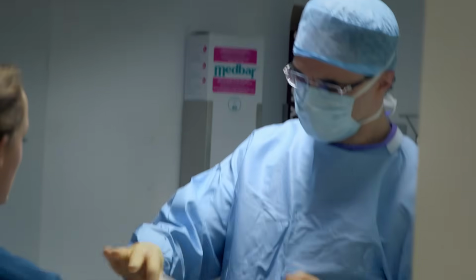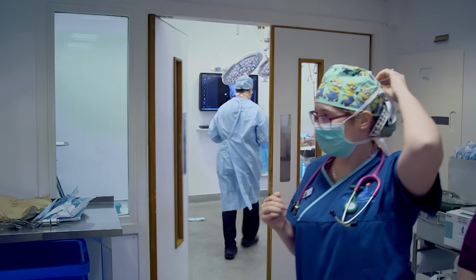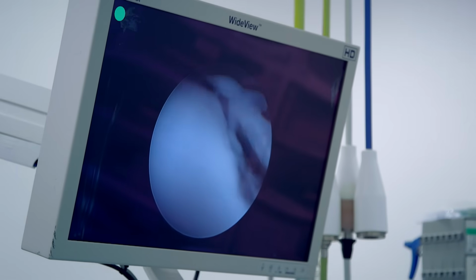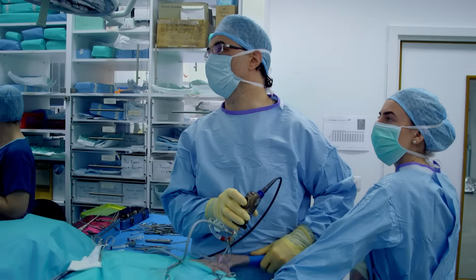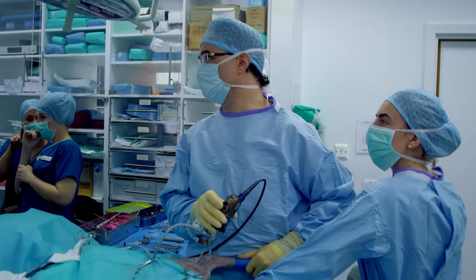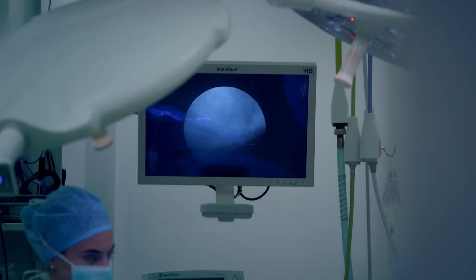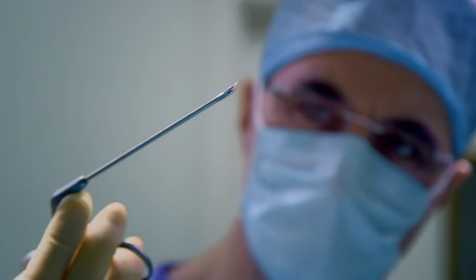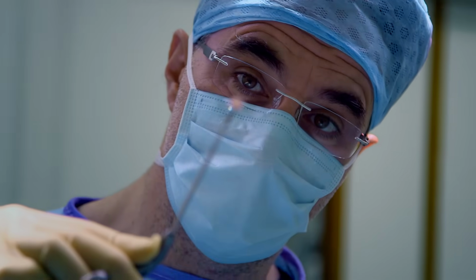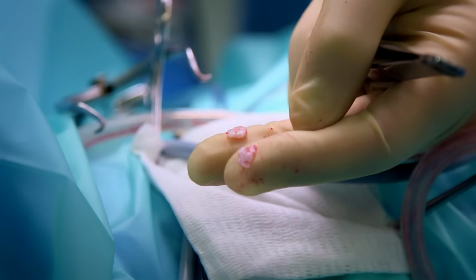First, Noel needs to inspect Flo's shoulder joint for damage. He will try to harvest living cells from the cartilage that has flaked off from the hole in the humerus bone. So I've got the camera inside the joint now, and it shows us this big flap of cartilage there. Okay, so that is the flap of cartilage from the surface that has flaked away. And it's actually in two big pieces, so it's quite an extensive flap.